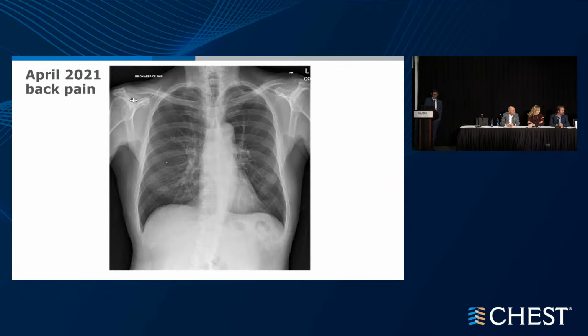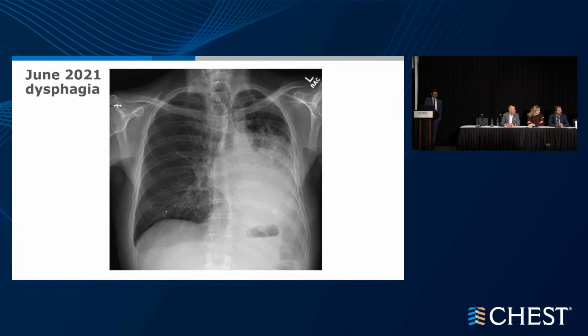Just to show you, he came into the ED in April 2021 with back pain, and this was his x-ray. They said there's nothing on here, gave him some pain meds, and said to follow up with his primary care. Then this was in June when he presented again, after his dysphagia symptoms. So, pretty significant difference.